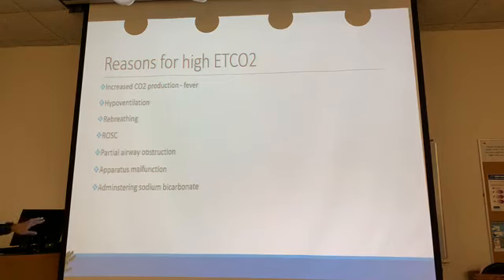If you give somebody bicarb, don't be surprised, your end-tidal CO2 will go up. And the reason it's gonna go up is because bicarb causes a sudden conversion of a bunch of hydrogen ions in your body into carbon dioxide, and all that stuff's gonna get dumped into the lungs. So that's just something to kind of remember, because it's gonna totally throw everything off.